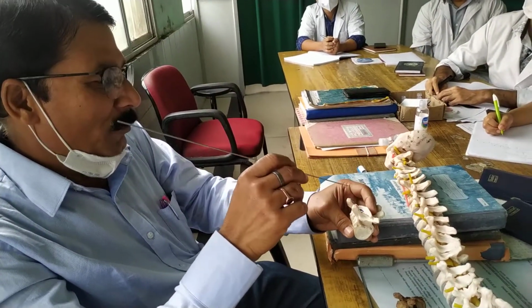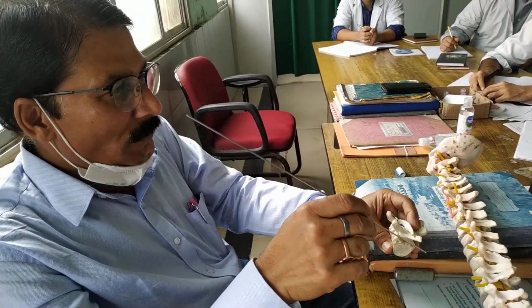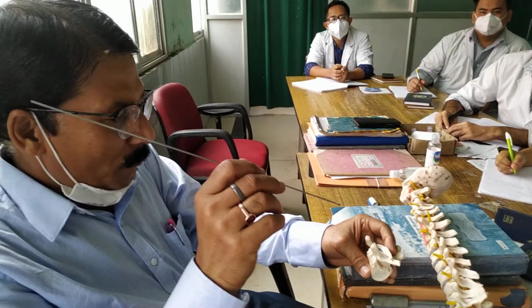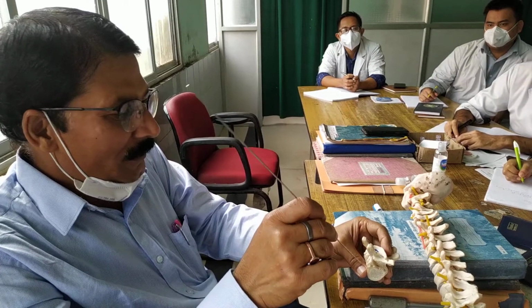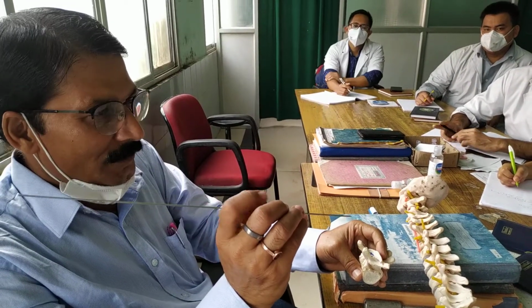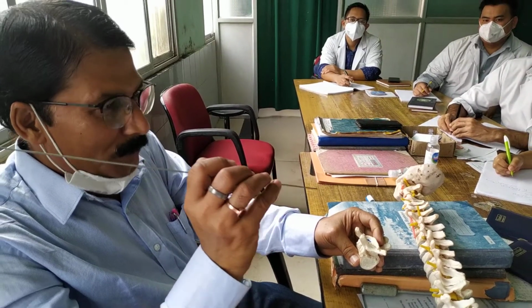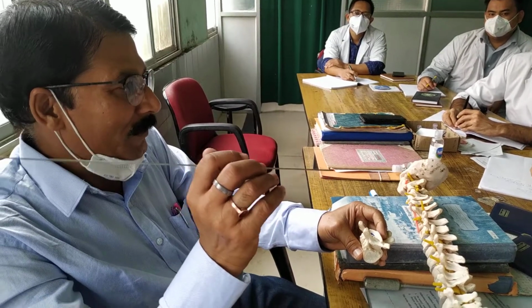Okay, sir? So it is important that you make a track, go in, do the trekking, then the sound is introduced, feel the borders, and take the depth. Depth means your measurement should be done with the sound which is going in. And that will determine the length of the screw.